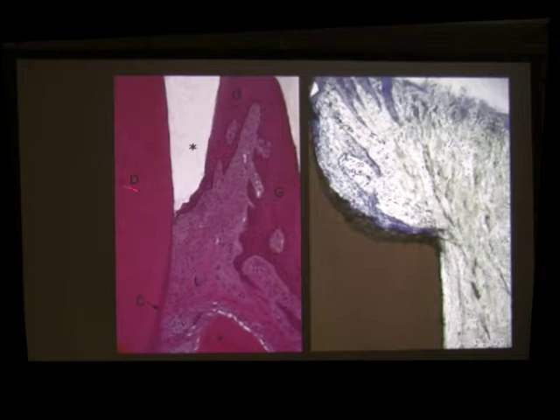This is the dentin, this is the cement of the tooth, this is the enamel portion of a natural tooth, and this is how the gum should look when it's healthy. And this is how the gum looks when there is no crown, because this implant doesn't have a crown, or when the crown starts no deeper than the first millimeter of sulcus. So the conclusion of this slide is: with zirconia implants, don't go deeper than the first millimeter of sulcus.